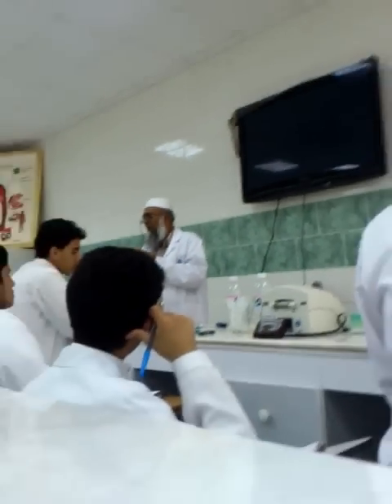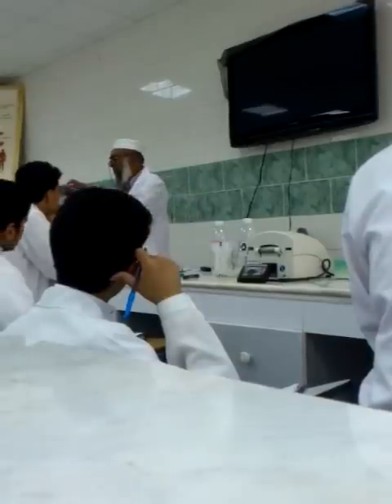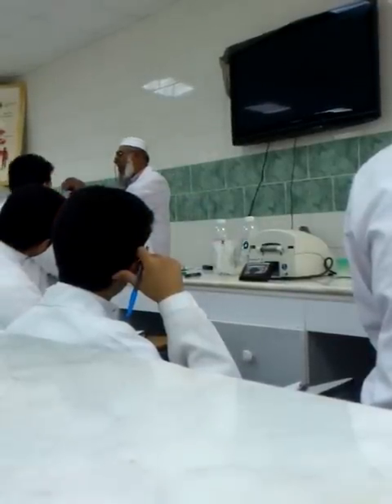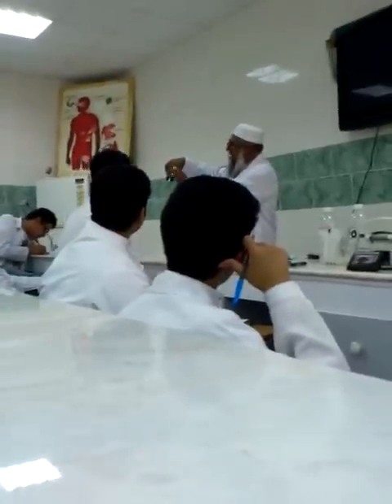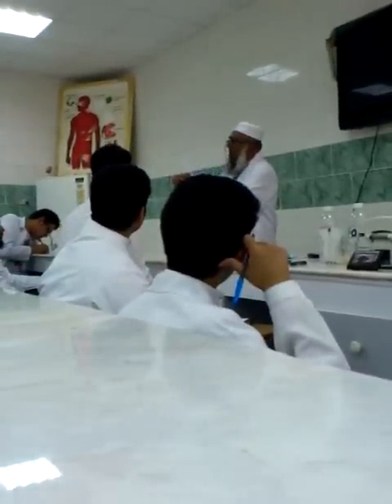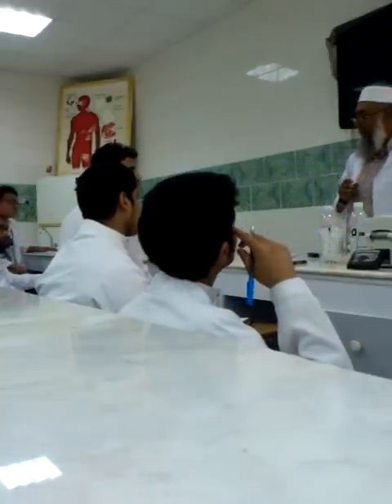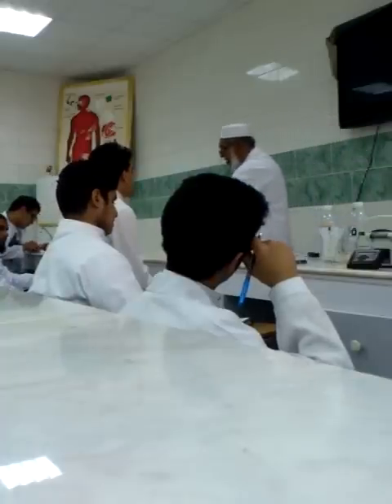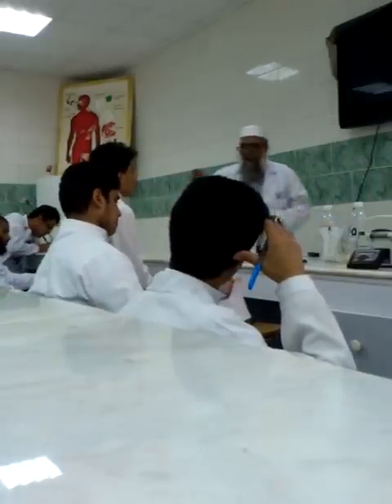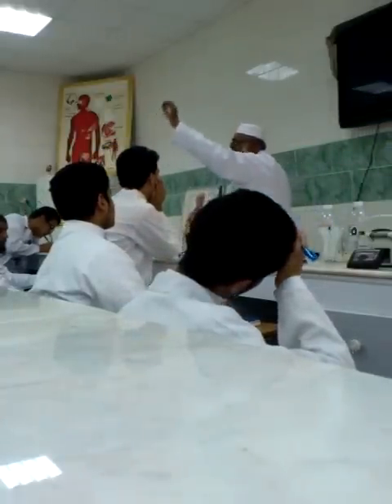And so you have to quickly clean your finger first, then prick it, press it, make a big drop, and then put the big drop on this lighting colored area. You can see the colored area is lighting as well. So on this lighting colored area, put the blood drop. Within a few seconds, the value will appear on the screen. But if you first take the strip, put the drop of blood here, and then try to insert it in the glucometer, it will give you a big letter E.